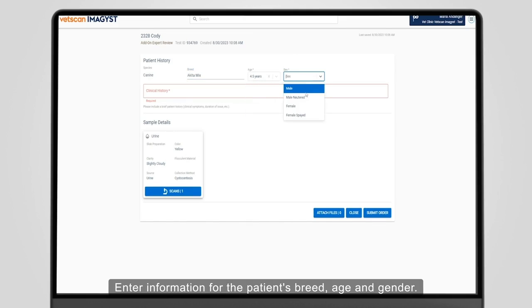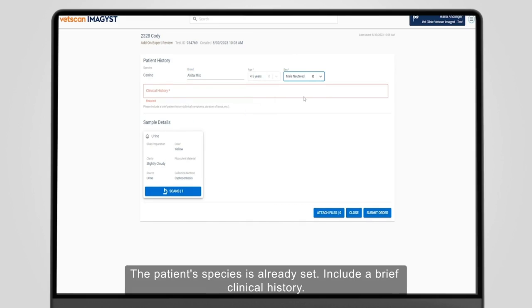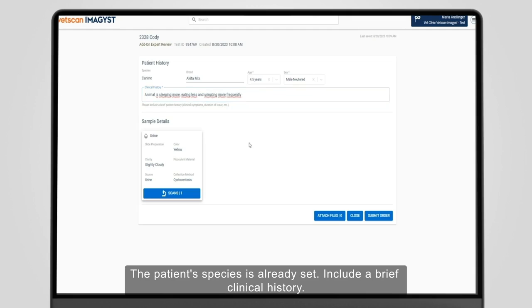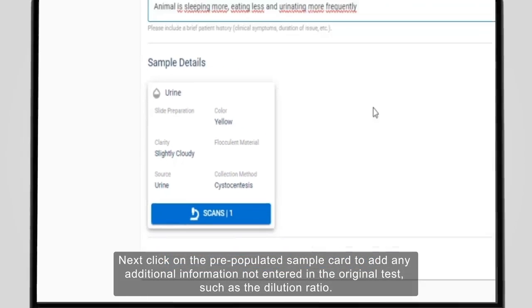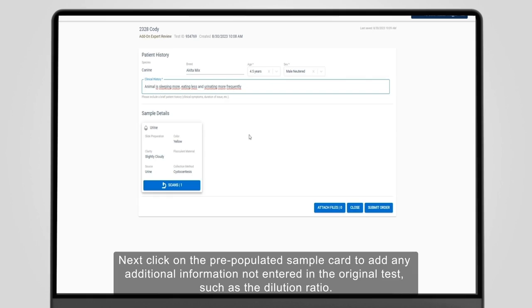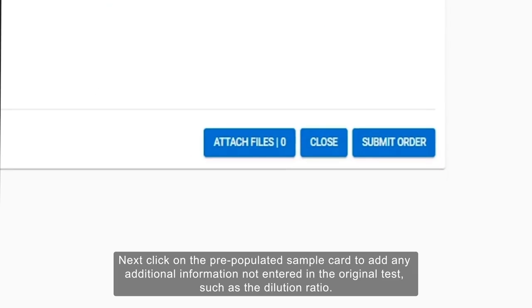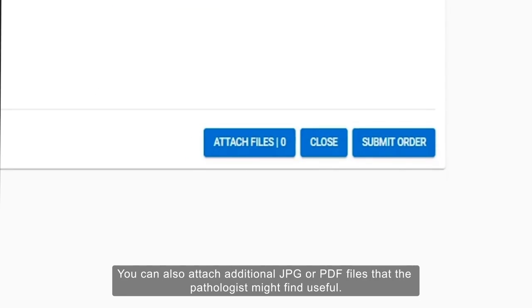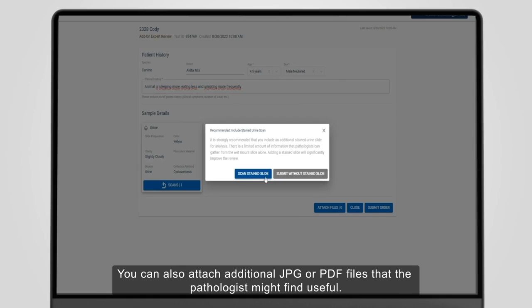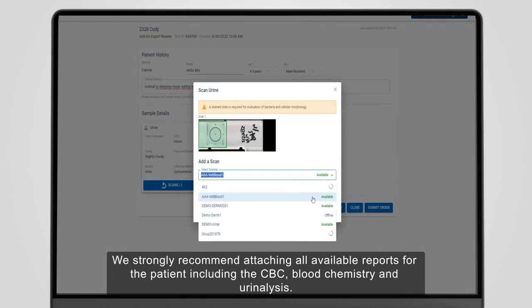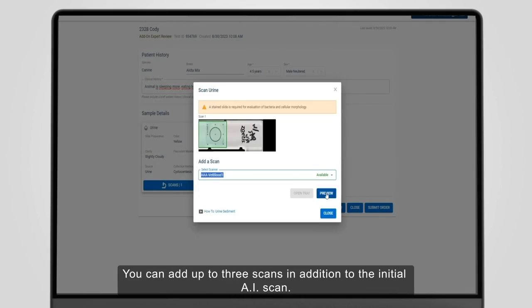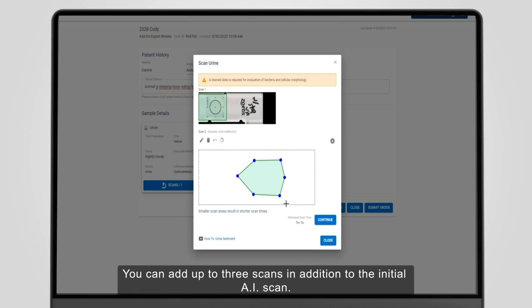Enter information for the patient's breed, age and gender. The patient's species is already set. Include a brief clinical history. Next, click on the pre-populated sample card to add any additional information not entered in the original test, such as the dilution ratio. You can also attach additional JPG or PDF files that the pathologist might find useful. We strongly recommend attaching all available reports for the patient, including the CBC, blood chemistry and urinalysis. You can add up to three scans in addition to the initial AI scan.